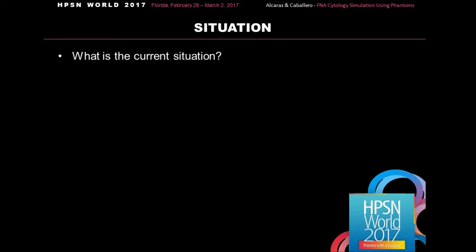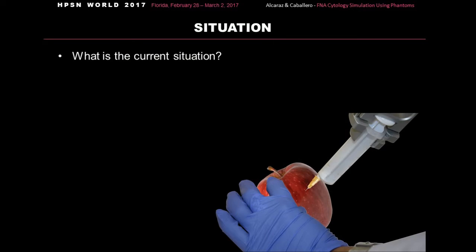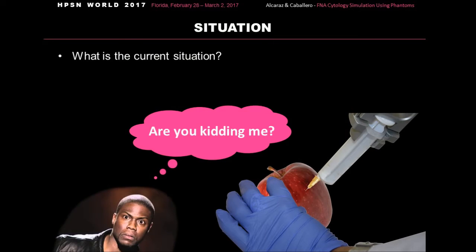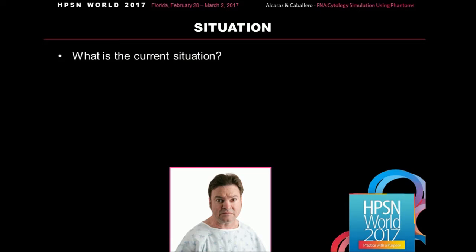What's the current situation? Does anybody know how it works in your institution? Well, in the few places where this technique is taught, this is done on fruits, believe it or not. Or what is worse, it is performed directly on the patient for the first time. And that was my own experience. I didn't feel safe nor comfortable, and I was scared of it. I still remember the face of the patient looking at me. I'll never forget it.